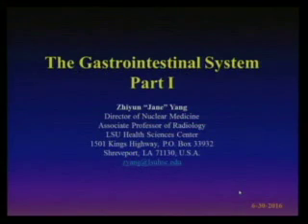Okay, so we start. So this is most of the on-call cases for the GI system.